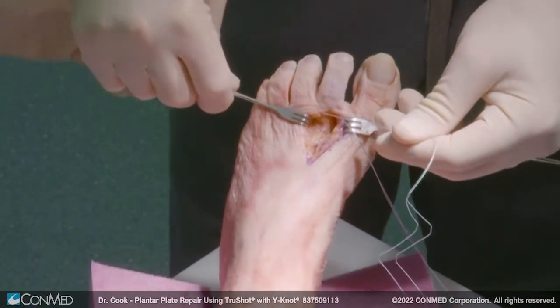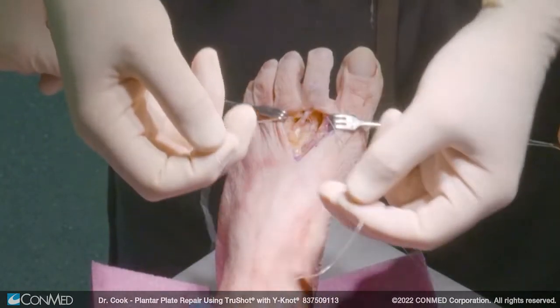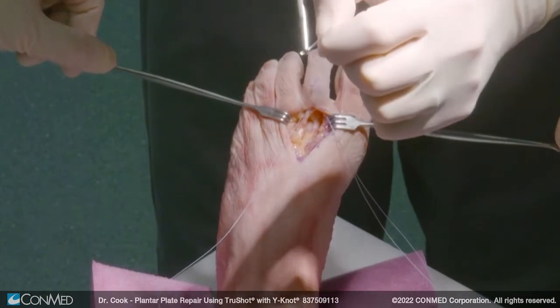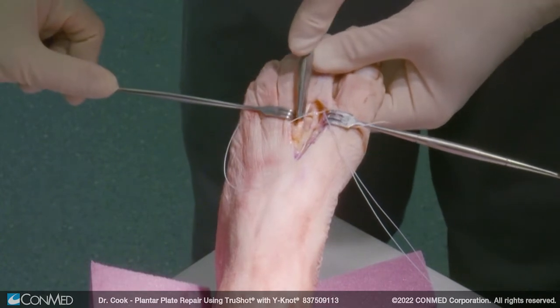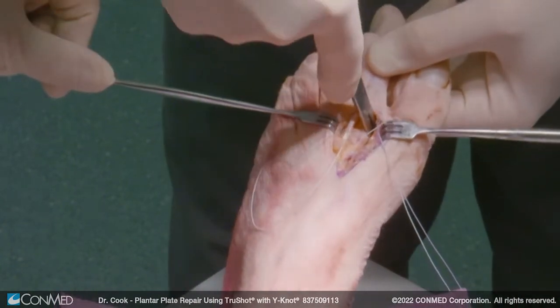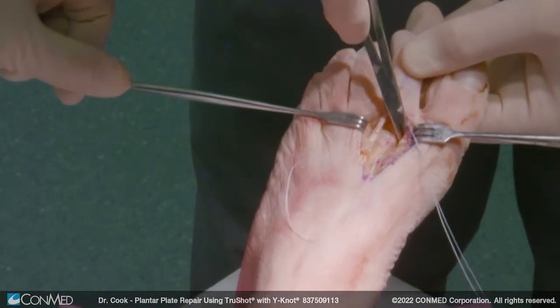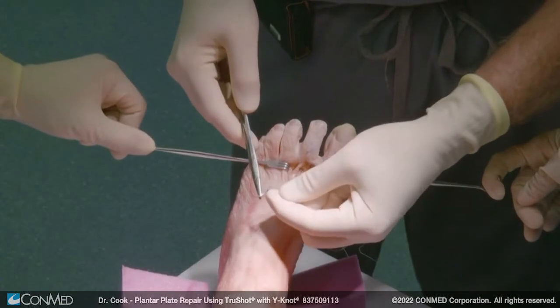We're going to take and cut one of these off, and I just leave the little foam pad on so I know which one's which. We have a separate needle size for females and males — basically two different diameters. You want to pass this inferior to the head and come around to the medial side, passing one in from medial to lateral. This can be a little bit of a where's Waldo, but usually you can see it come around. You want to be through the plantar plate, which is right underneath the metatarsal head, so you want to stay on the metatarsal head and pass this one from medial to lateral.